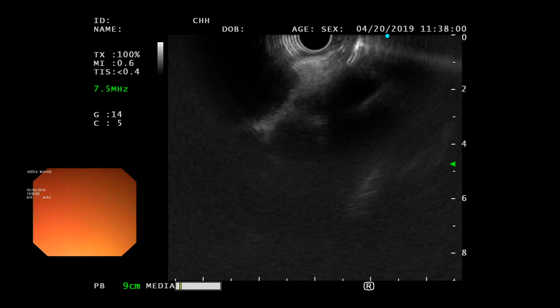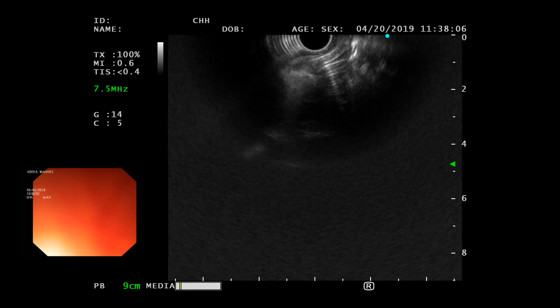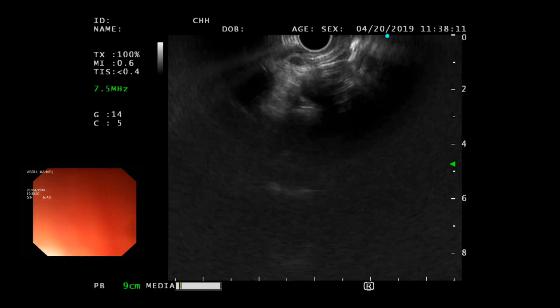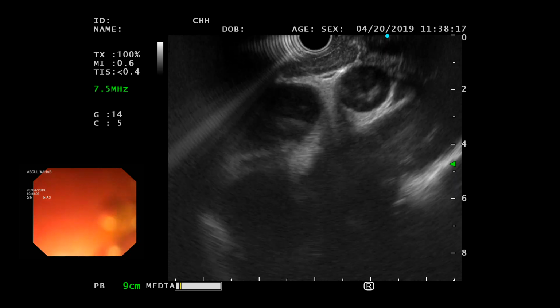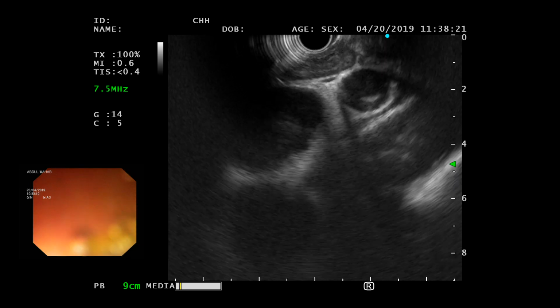go of your big wheel a little bit. So we'll show you what I was just telling Dr. what happens. Take the air out please. Dr. Saab was pretty good until the camera came. Okay, so yeah. See, now let go of your big wheel. Away, big wheel away. Yeah. Now bring the big wheel up towards you, exactly.